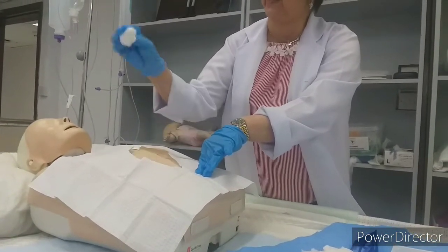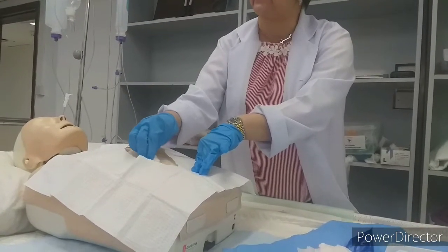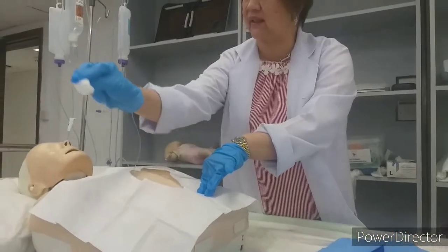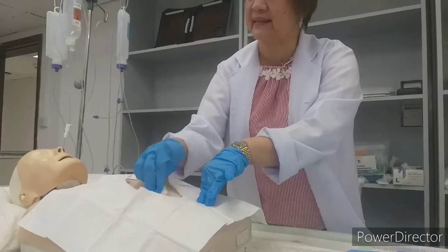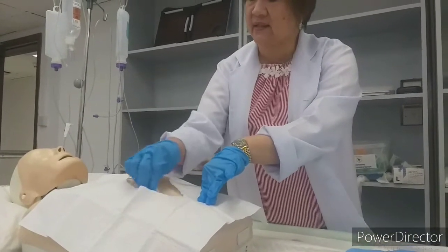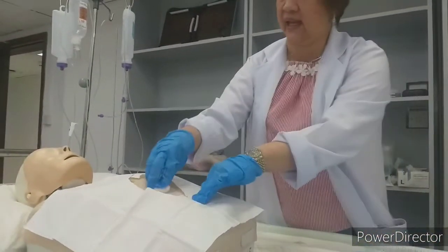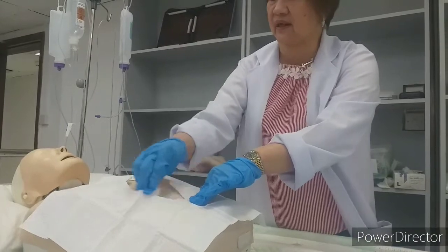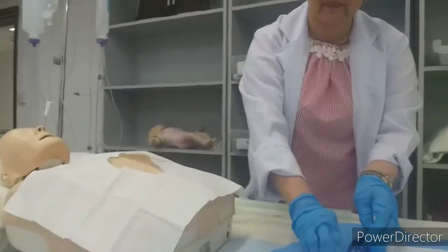Even for your swabbing, anything, you just go with the circular. Out. Never, never come back or do like this. In, circular, to the surface, out. In, circular, surface, out. Now, let's dry it.